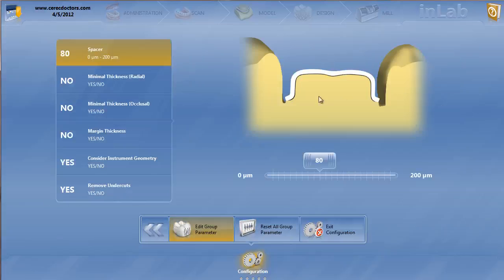If we click on crown framework, this is just simply making a coping. This is a technique that is done a lot by labs if they want to layer it, if they want to make a coping out of metal or zirconia.